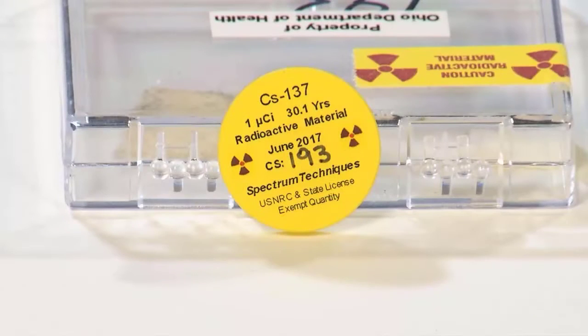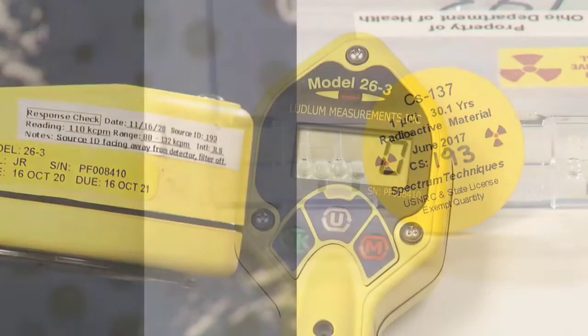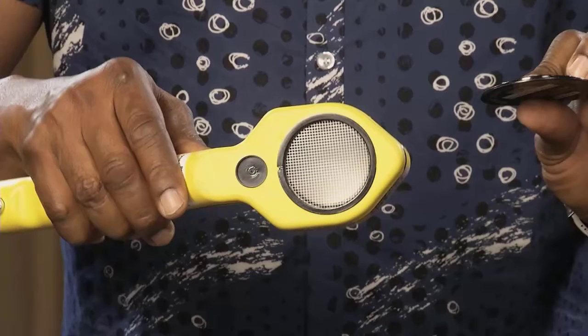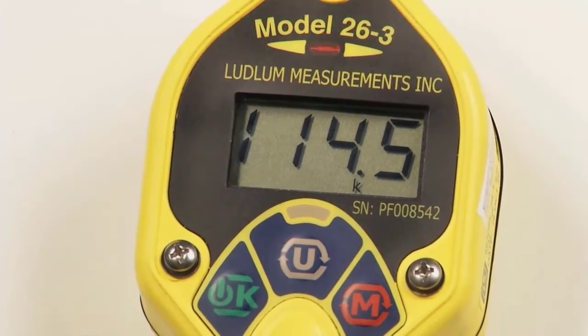Before using the instrument, a source check or reference reading should be performed. Use the supplied one microcurie cesium-137 check source. Compare the source ID number located on the source to the source label on the side of the detector — they should match. A quick method for performing a response check is to have the detector in rate mode and the units in CPM. Without using the dose equivalent filter, place the detector window over the source and note the count rate.